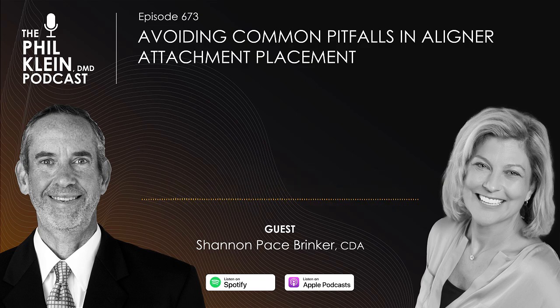You like to stay within the same system, which is Ivoclar. That's why you prefer the Adhese Universal, which you've had a lot of success with, but you feel more comfortable staying with the same system. You put that on, and then you light cure it. Now that material uses a power cure light, right? So tell us about that real quick.